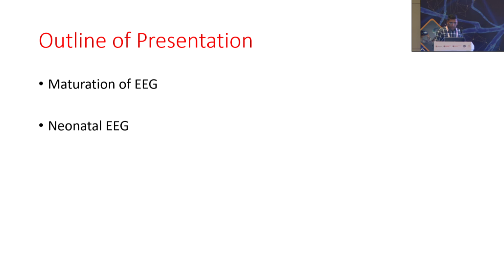Welcome back, everyone. So I think we have a short 45 minute session on pediatric and neonatal EEG. I know this is not usually sufficient to understand, but we'll try to focus on those things which are a little different from older children or adult EEGs.